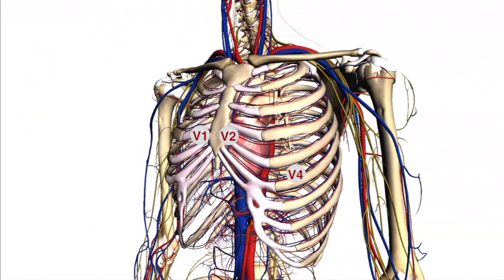For V4, find the midpoint of the clavicle and count down to the 5th intercostal space. The electrode should be placed here. For V3, the electrode should be placed midway between V2 and V4.